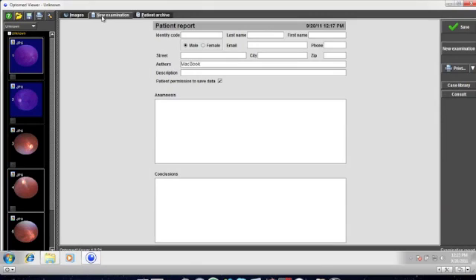Now, let us move on to the patient report. Click on the new examination near the top. You will see a patient report card appear. Fill out as necessary.